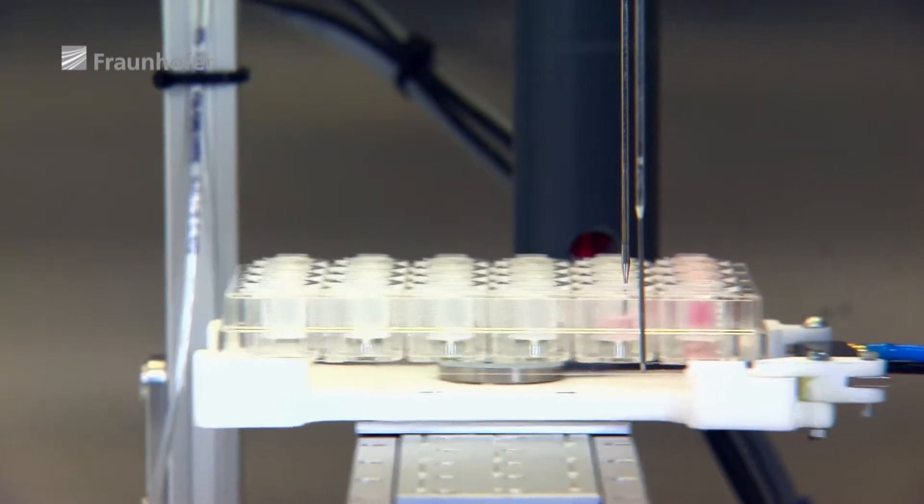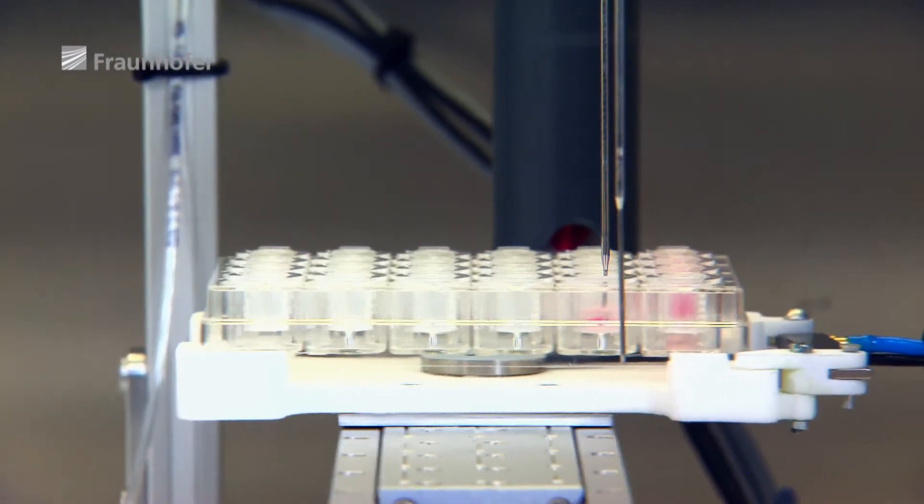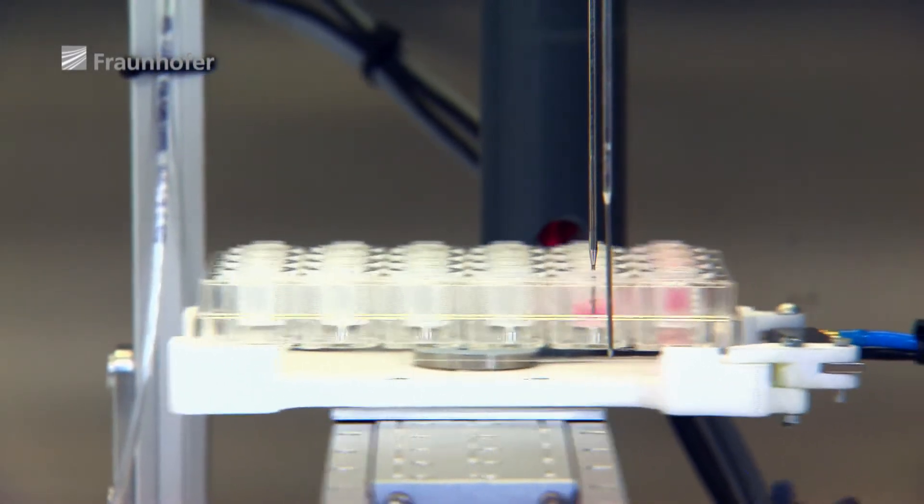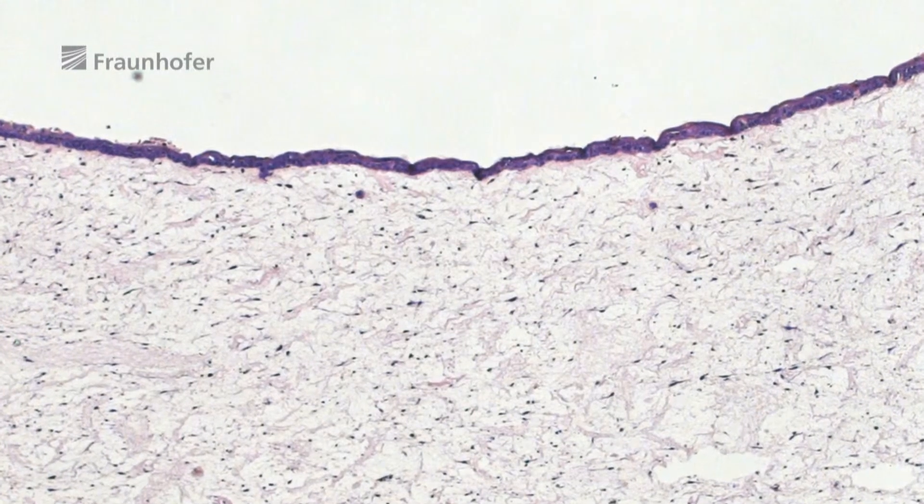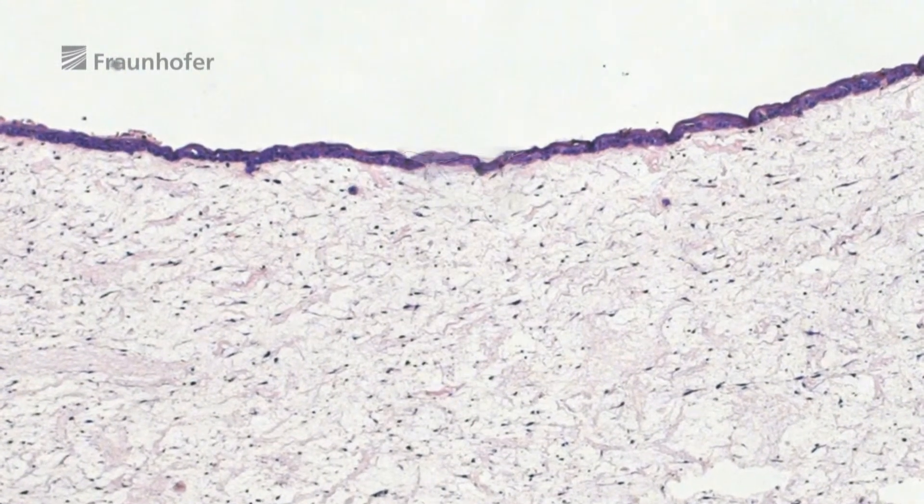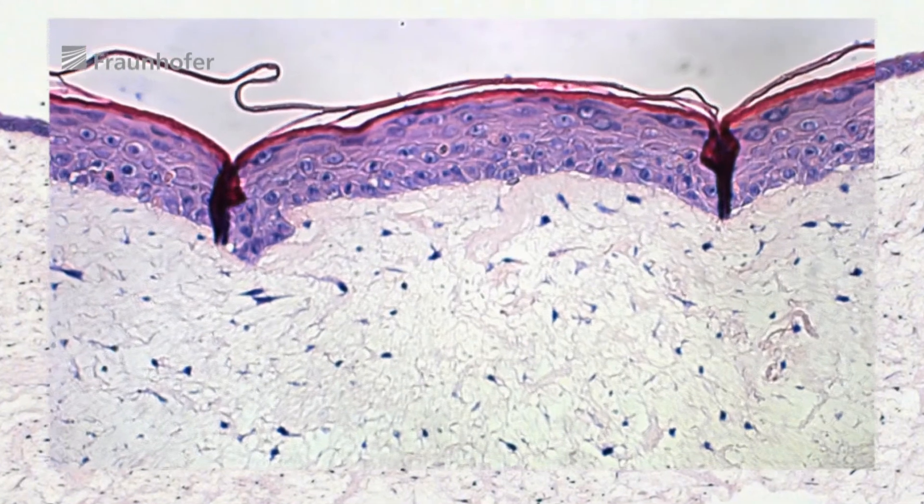Mixed well with collagen, within about two weeks, each of the small plates holds a full-grown, three-layered piece of skin, just like human skin, with the epidermis, dermis and subcutis.